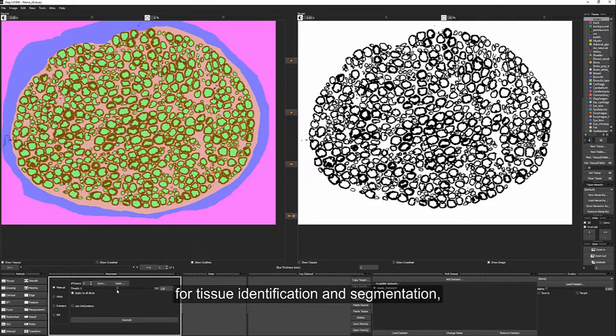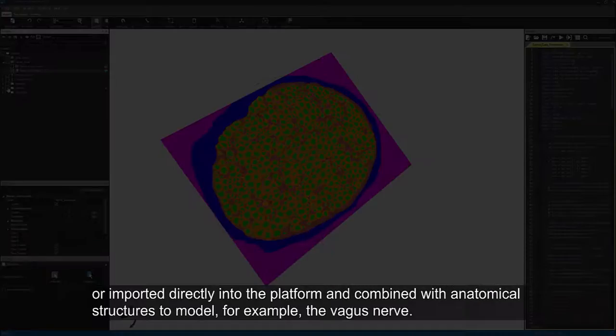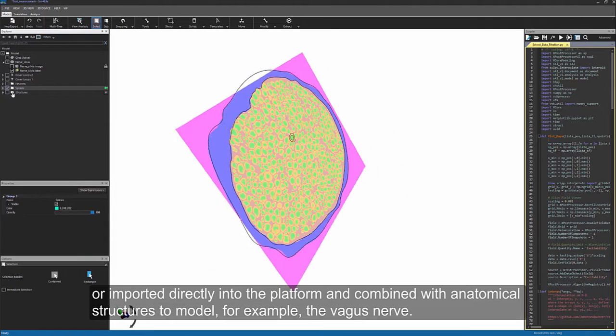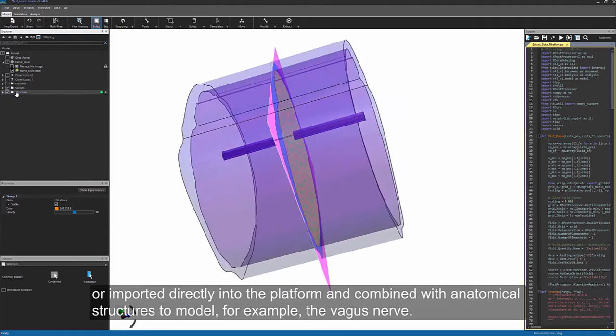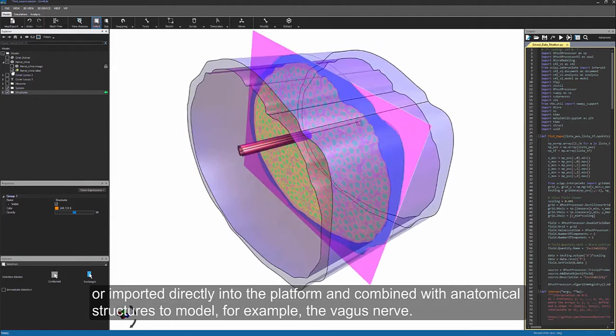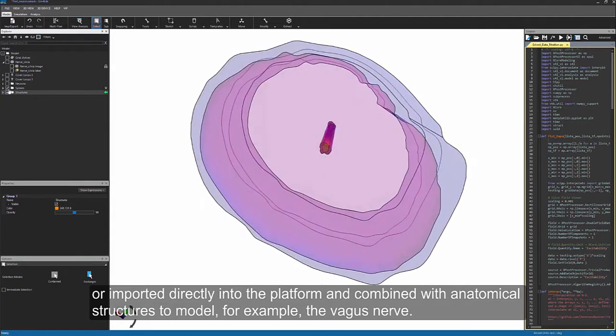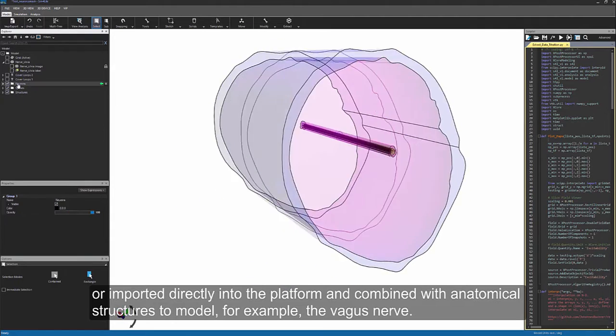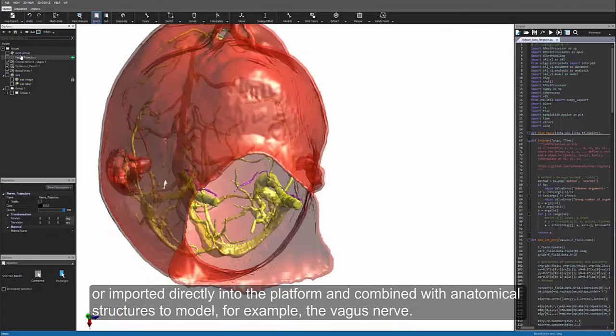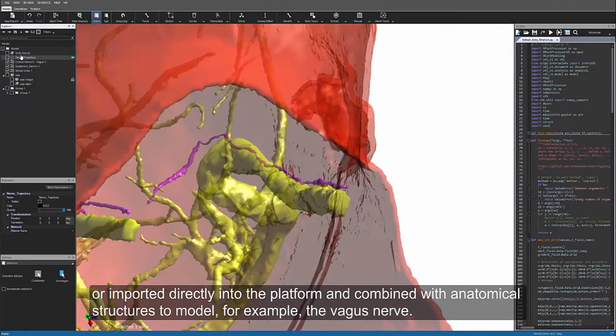These are called tissue identification and segmentation, or imported directly into the platform and combined with anatomical structures to model, for example, the vagus nerve.